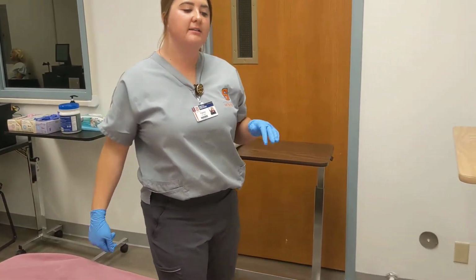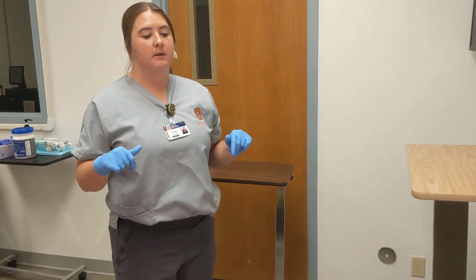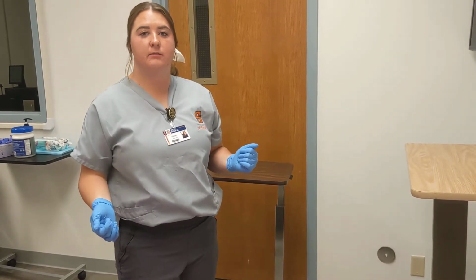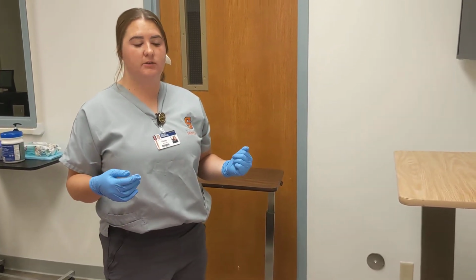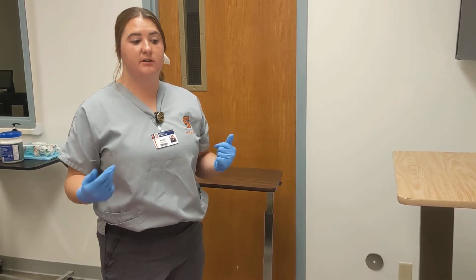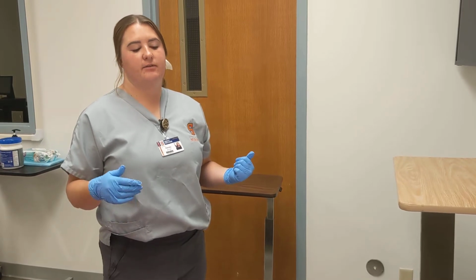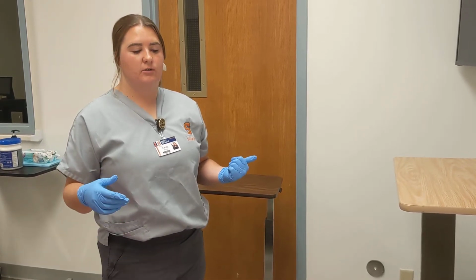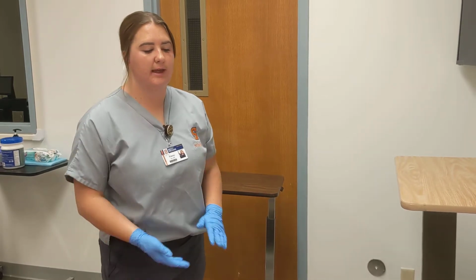And now we can discuss, so I'm just going to tell the patient about the procedure that we're going to be doing. So I'll tell them all about the Foley catheter. I'm going to ask them their ability to help me during this procedure, and I'll also remind them, once we have the sterile field open, to just not touch that. And then I would ask them if they have any allergies to iodine or latex, and they do not. So that is great.